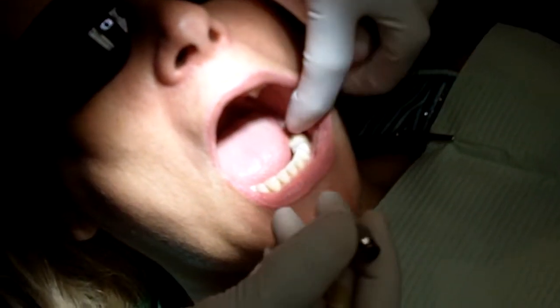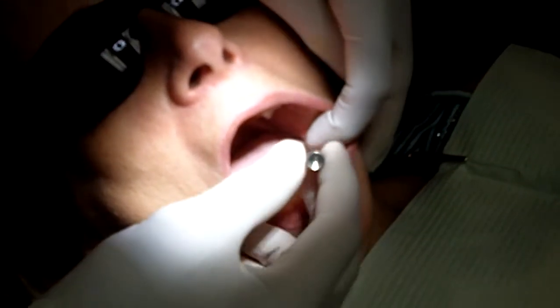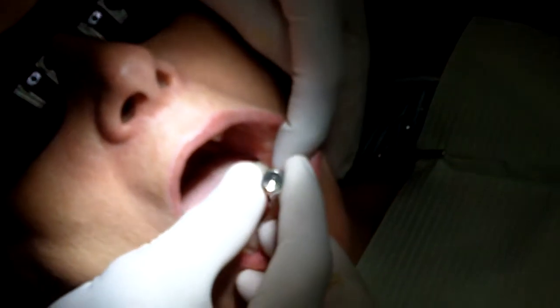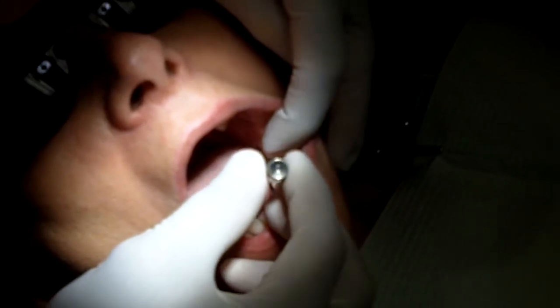Alright guys, this is Dr. Jesse Sidhu from SafeVac. I'm going to show you another procedure today in which SafeVac is going to help me out. We're going to be removing an implant healing abutment and placing a permanent abutment in here.